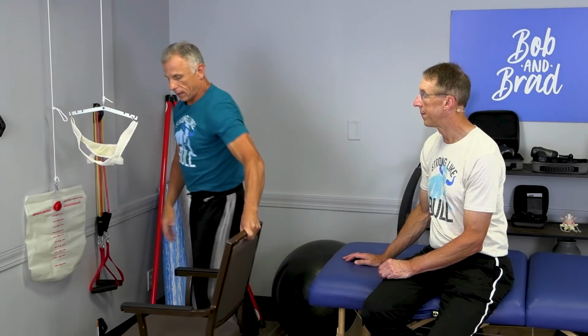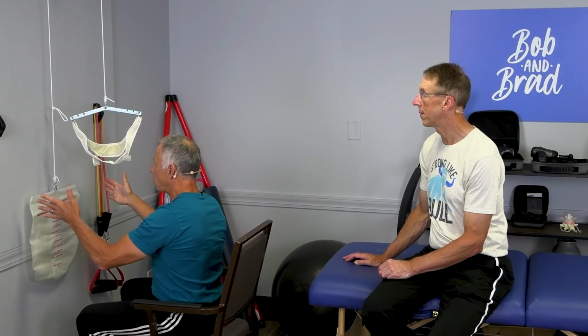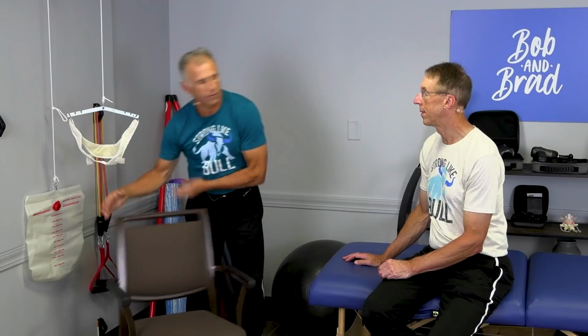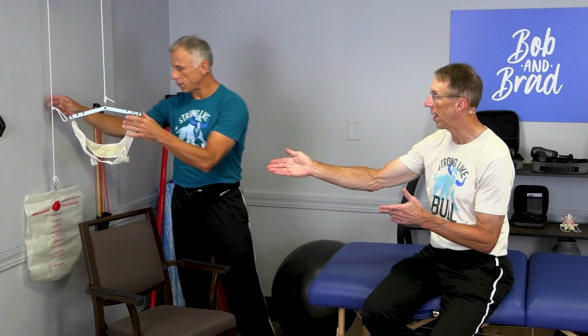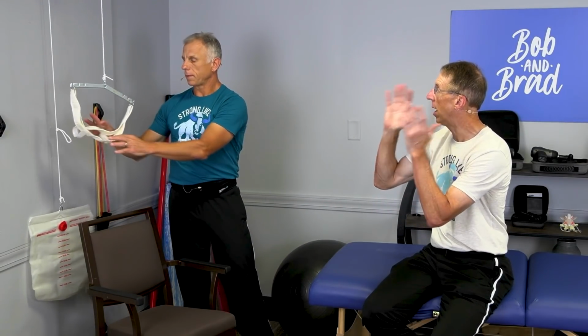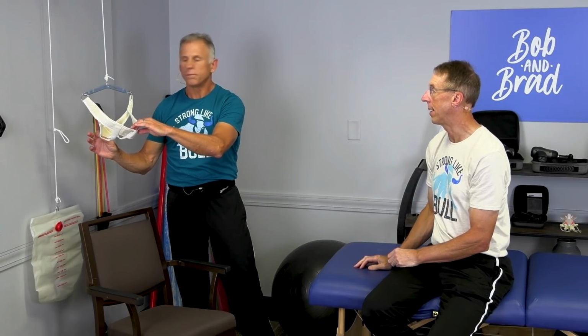Sometimes I'll have the person face the door. And if that doesn't work so good, I may turn it around and have the person go both directions and do whichever feels most comfortable. As I recall, Brad, last time I actually bought one of these units, and then I spent a little more money on the harness. I went and bought a harness separately. A little better harness.